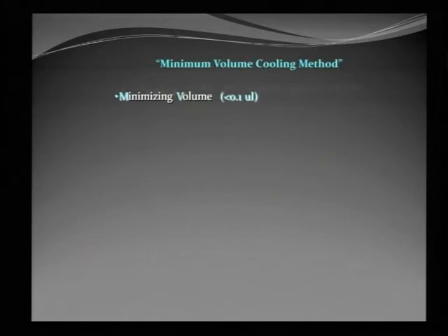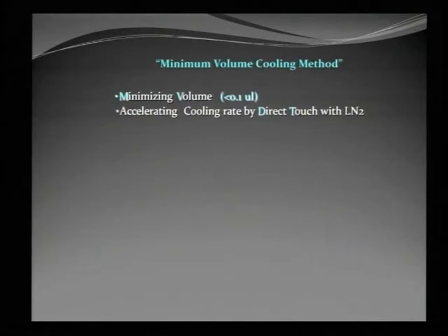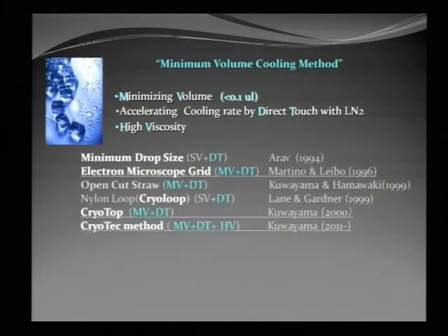And accelerate the cooling rate by direct touch with liquid nitrogen. More than minus 10,000 degrees per minute is required for ultra rapid cooling. And higher viscosity is required. To realize that, first in 1994, Dr. Arav proposed the minimum drop size method. And this is not minimized, it is still bigger. So I say this is small volume plus direct touch, DT.